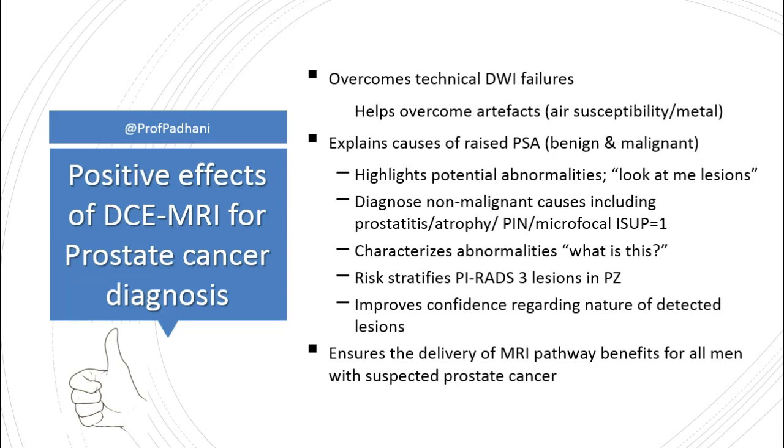Undoubtedly, it highlights look-at-me lesions. It also helps to diagnose non-malignant causes of a raised PSA, such as prostatitis, atrophy, or PIN. It can help risk stratify PIRADS 3 lesions in the peripheral zone, which is why it's incorporated into the PIRADS system, and it improves the confidence regarding the nature of the detected lesions.